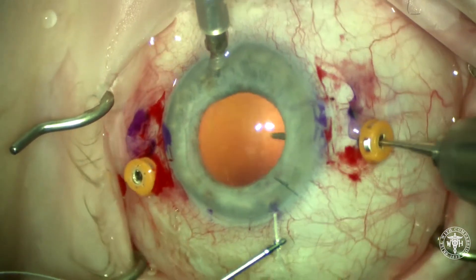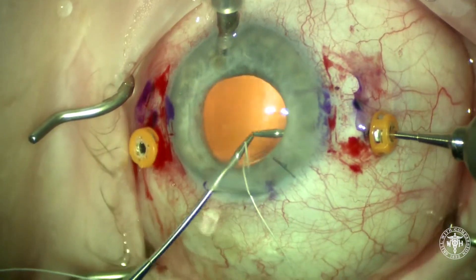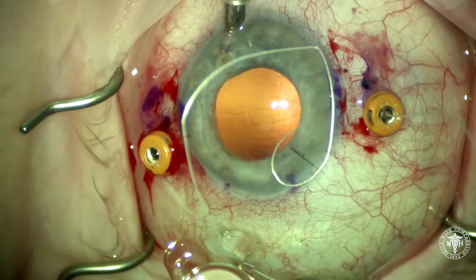Here I'm using two Snyder Graspers made by MST, and these two graspers are oriented 90 degrees apart. We're grabbing the 8-0 Gore-Tex suture inside the eye and retrieving it through the sclerotomy.